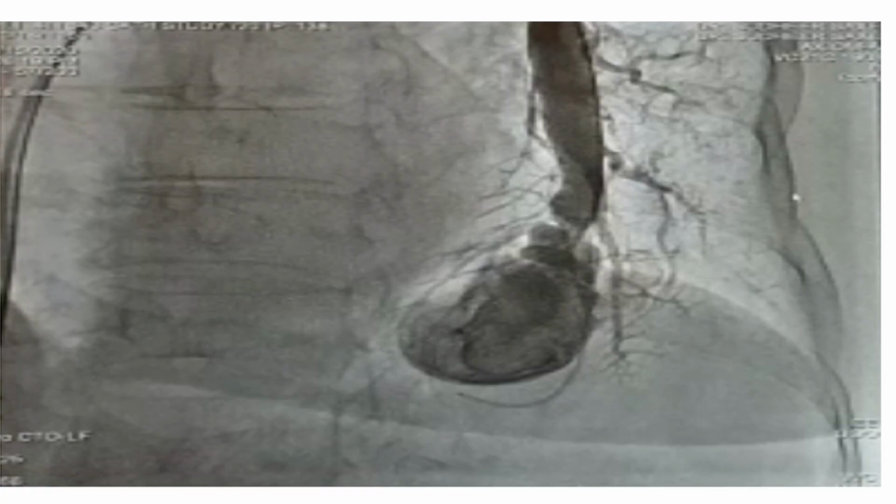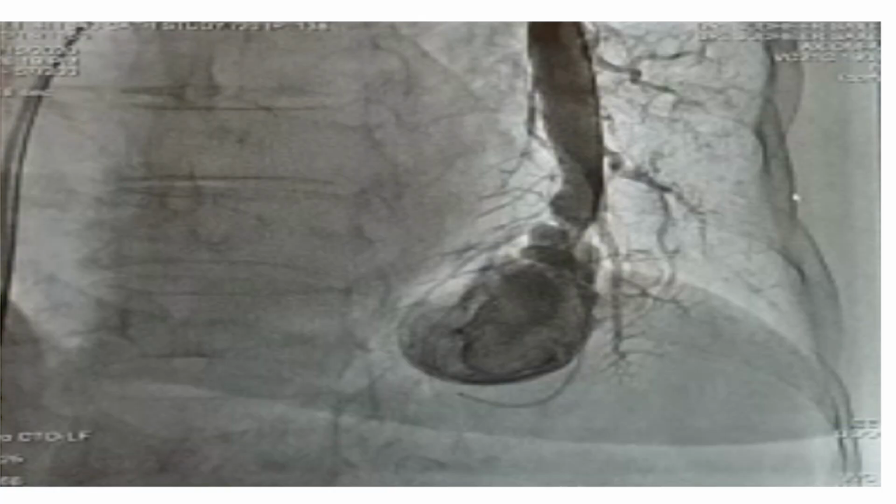Last year, one of them was post-COVID, and that was the mother of a doctor, and she had dyspnea, and saturation started coming low. When the X-ray was done, there was a huge opacity on the left side, and then the pulmonary angiogram showed that there was an AVM. It was on the left side, and it was a huge communication.